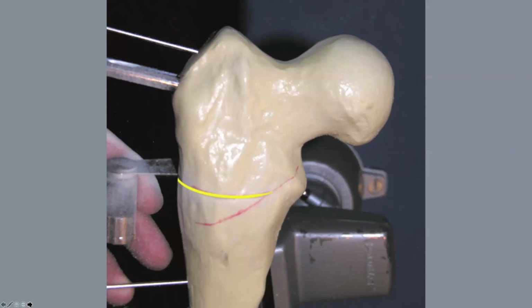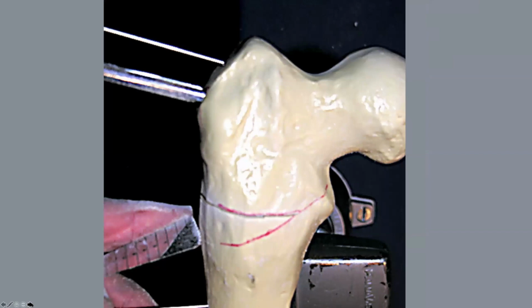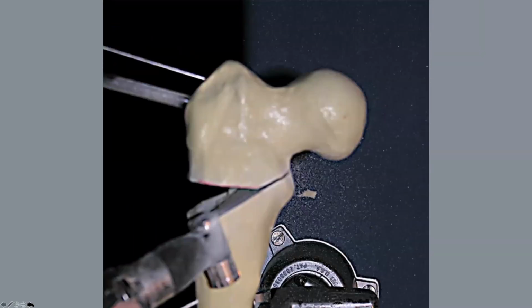Or if you make it second, you don't want to complete the long cut. So let's say you want to start with a long cut. You'd only take it up about 3/4 of the way, and then you'd make the short limb of the cut. And that's because things become relatively unstable once you've dissociated the proximal segment from the distal segment. So it's helpful if you have completed the short cut before you make that long cut. And that would typically be what I would do.